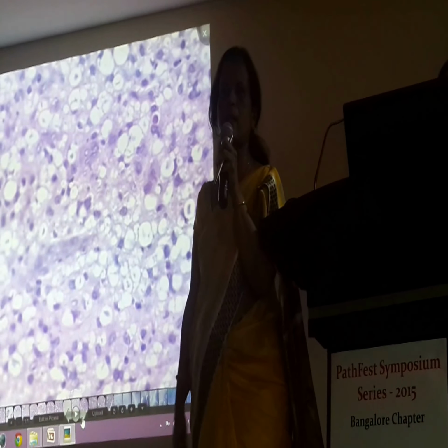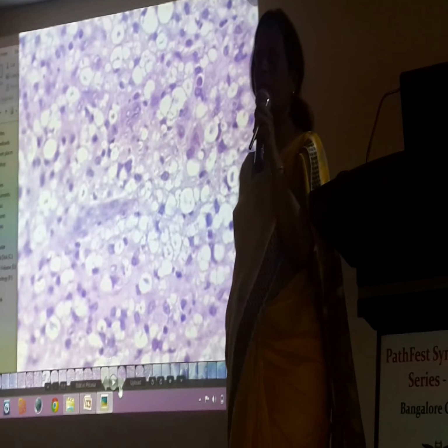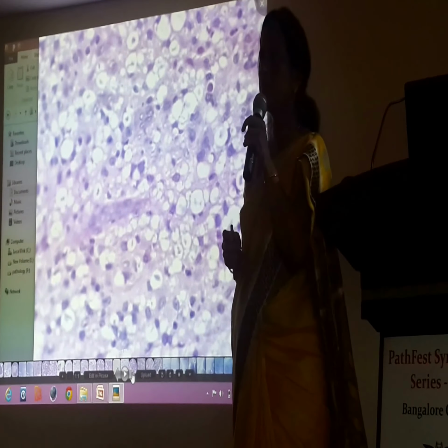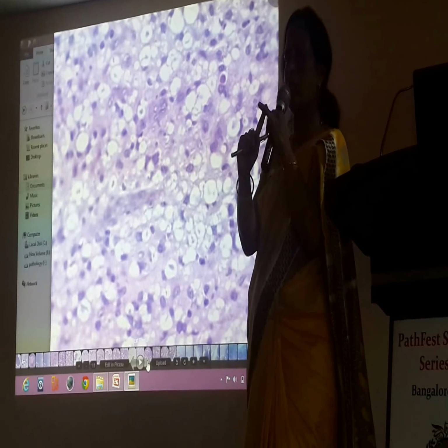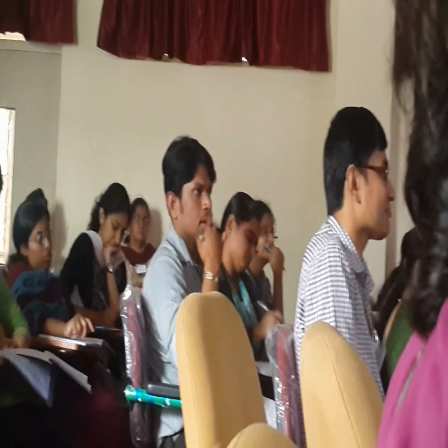So we did a Ziehl-Neelsen stain. So what is that Ziehl-Neelsen stain we should do here now? Modified Fite-Faraco, Wade Fite-Faraco. What is that modification? You need to use less acid. Then, what is the modification? First step. Yeah, we are heating the smear, that's all, not the section.